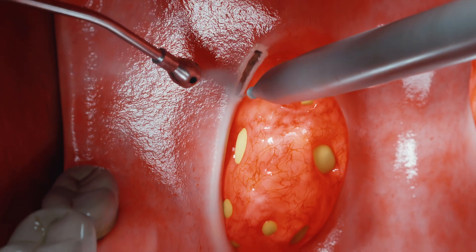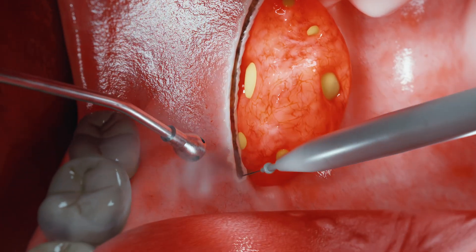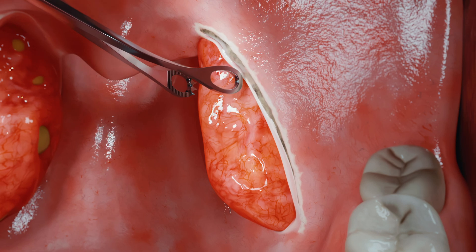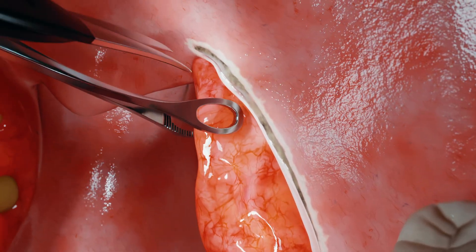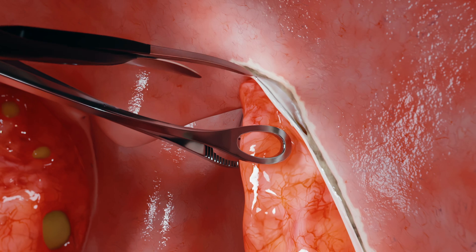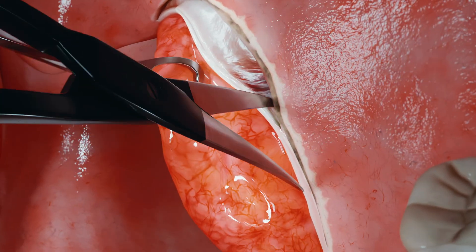The tonsil is separated from its capsule and surrounding tissues. The tonsillar bed is carefully inspected, vessels are coagulated, and, if necessary, treated with a hemostatic agent.